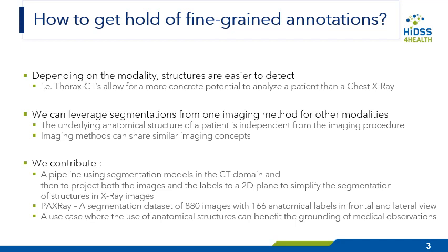Furthermore, some modalities can share similar concepts. For example, a CT being an aggregation of multi-view chest X-rays. Building on top of these assumptions, we contribute a pipeline for the automated generation of datasets for chest X-ray segmentation based on segmentation models in the CT domain.